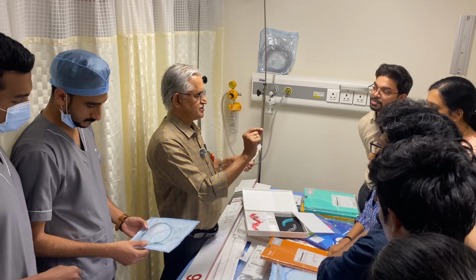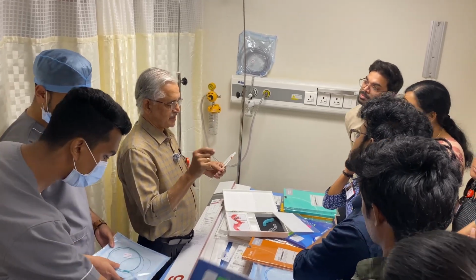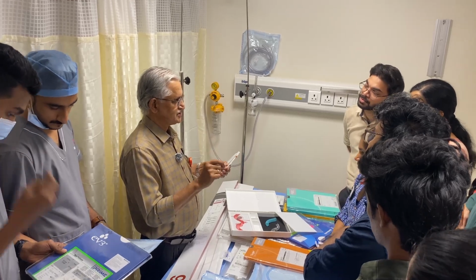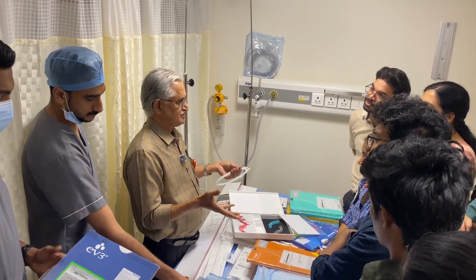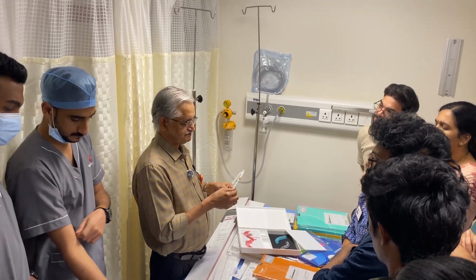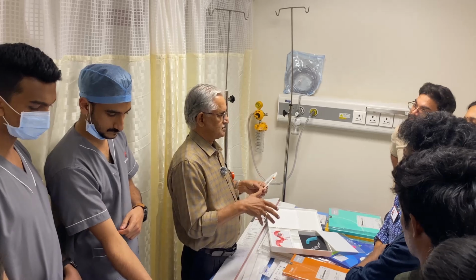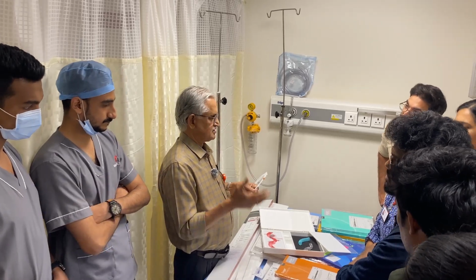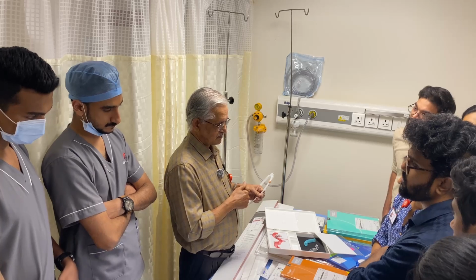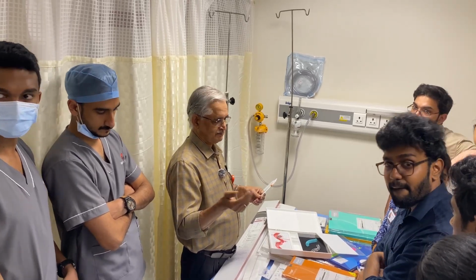It should not touch the aneurysm dome, because that is a very soft part, and even minor manipulations can produce aneurysmal rupture. Intraprocedural aneurysmal rupture sometimes you may not be able to manage. The patient can die, a very grave complication, even though you can manage it with medicines, reversal of heparin and so on. All the medication aspects, I think our anesthetist is talking about.